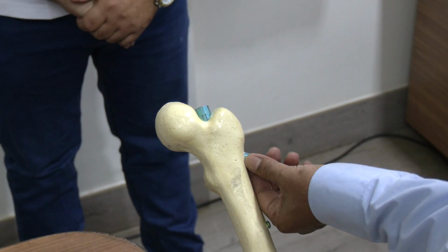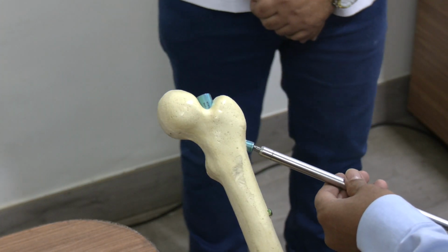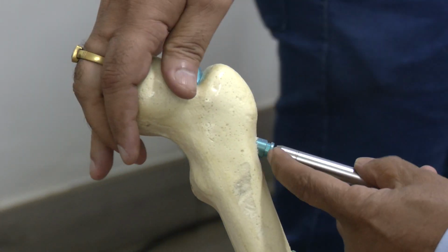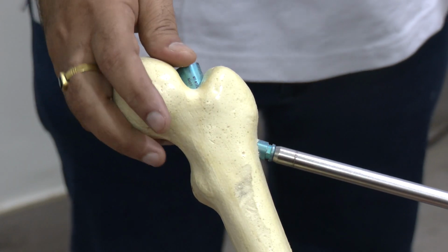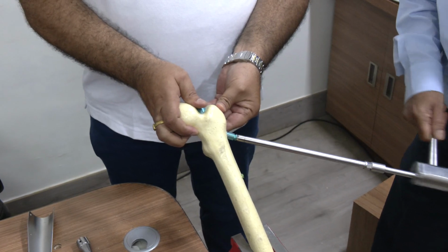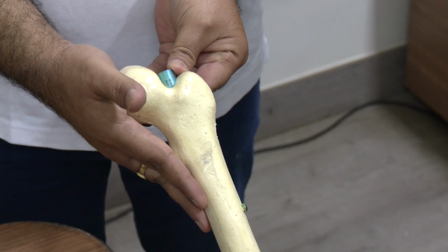Now coming to the removal set. If you want to remove this instrument for whatever reason, you attach this removal set, and once you attach and rotate this, the helical blade gets unlocked. So the helical blade gets unlocked, and with the hammer you can take out, you can see here, that helical blade.